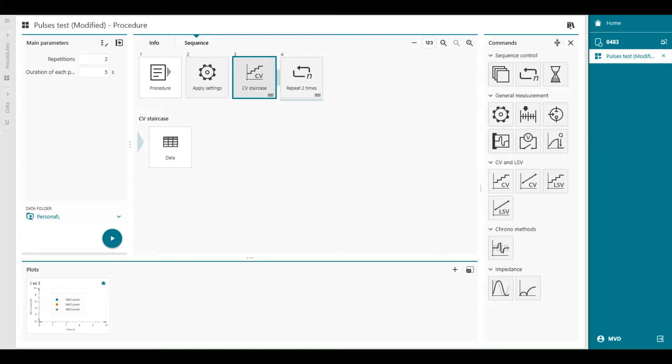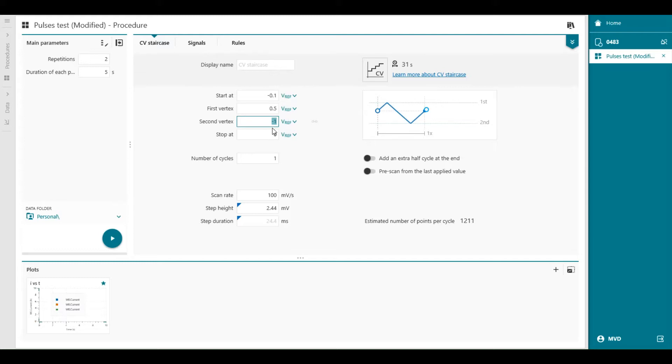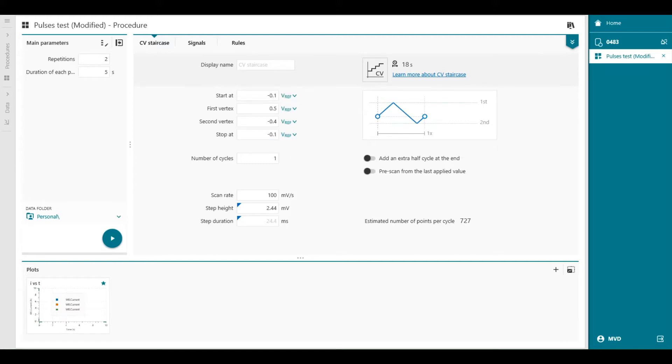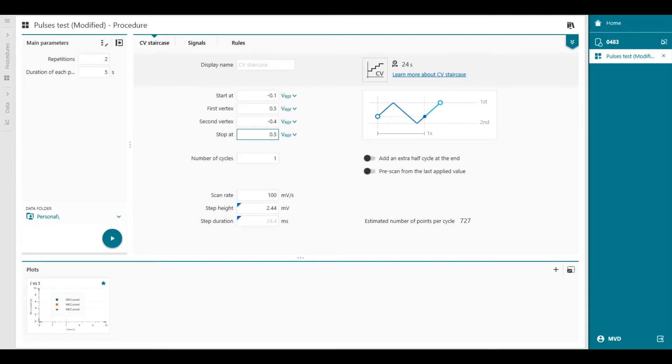Let's configure the CV waveform. So we open the CV staircase, the start potential minus 0.1, first vertex 0.5, second vertex minus 0.4, and the stop potential minus 0.1 volt. Please pay close attention to the waveform plot on the right as we adjust the CV waveform, this one here. For example, if you change the stop potential at 0.5, you immediately see that the example of the waveform is changing as well. This waveform plot was added to make it very clear how the configured cyclic voltammetry waveform will be applied.